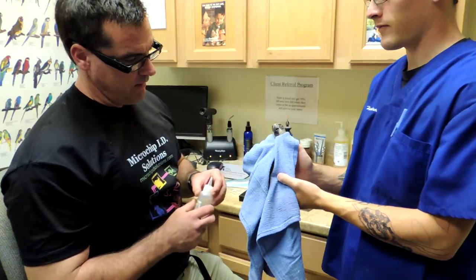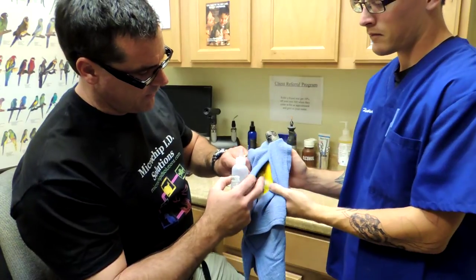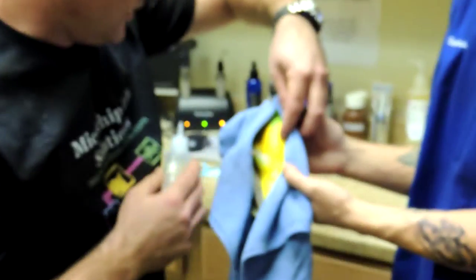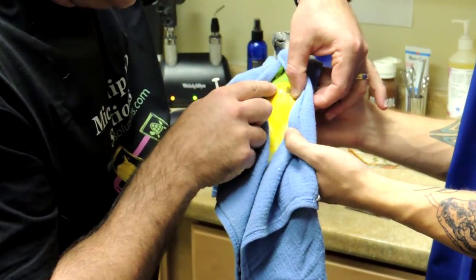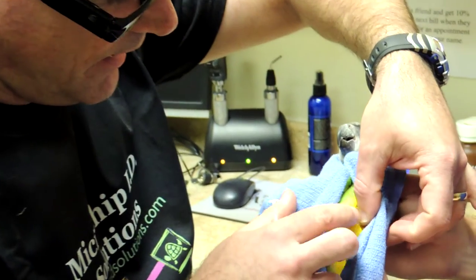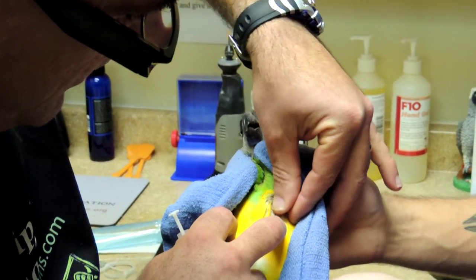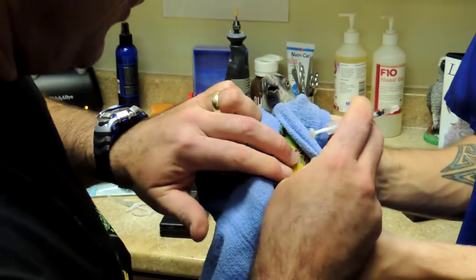This is Sammy, a Senegal parrot, and we are going to give him a Microchip ID Solutions microchip. We will do that by giving him just a numbing medication on the left side of his chest. The way we actually do it is we'll feel the keel and go about halfway in between the side of the body and the keel, and we will mark that area with a black marker.